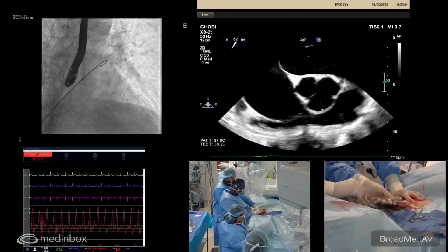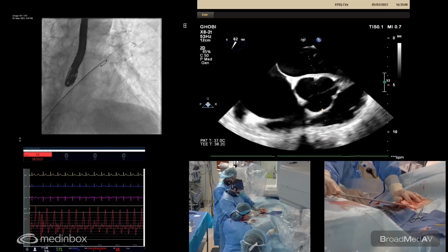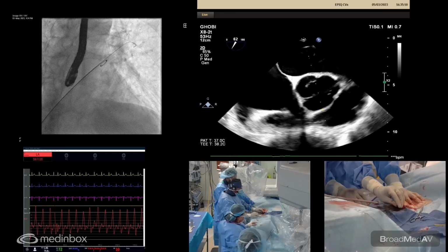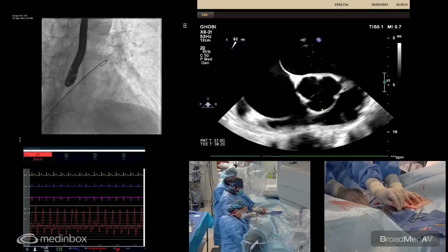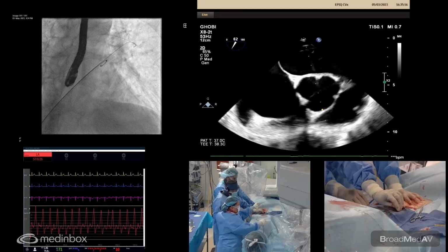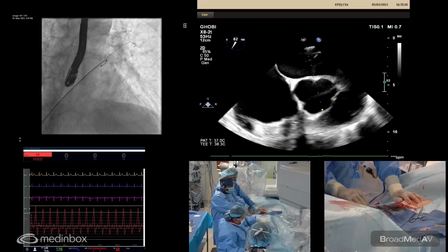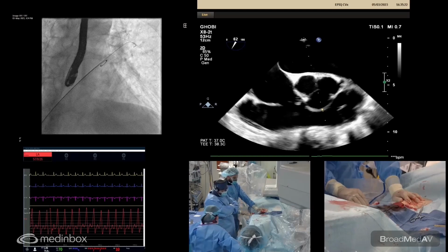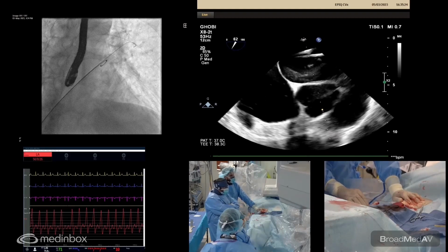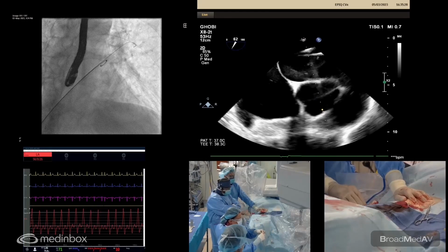Hold pressure now. So we've dilated the femoral vein. And now I'm going to advance, so basically I have a pigtail catheter over one wire into the left atrium and the second stiff wire in the pulmonary vein through which I'll advance the guide catheter. And based on the anatomy that Gabriel showed, I think we should use XTW, right? I agree, yeah.